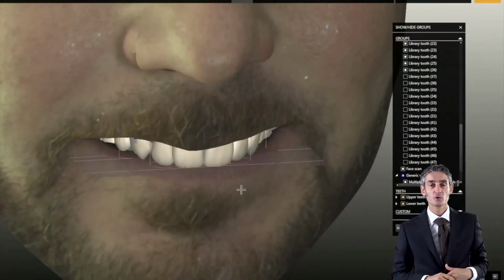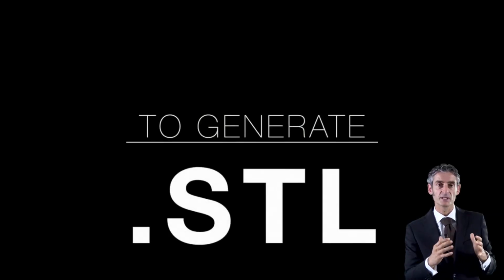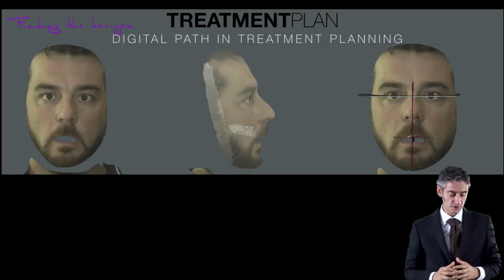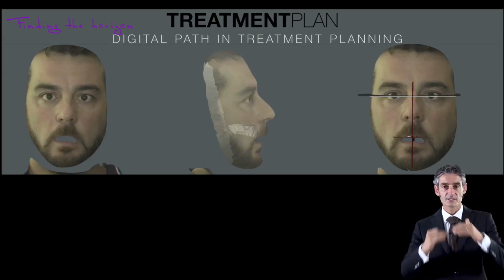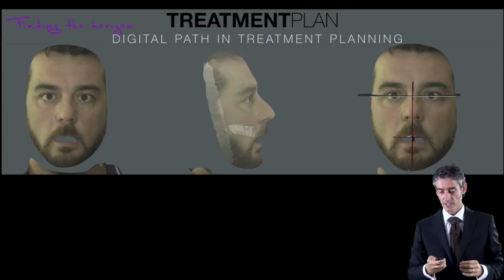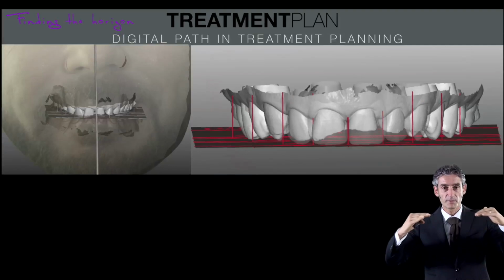So getting back to the concept that we saw before, considering the mouth of the patient as an empty space, when we have to plan with this kind of tools, what we can do is start from the empty mouth and then start to design our horizon, the midline, and all the other elements, and create the occlusal plane orientation.